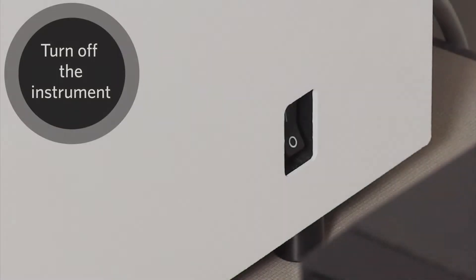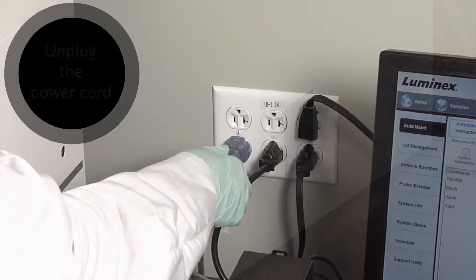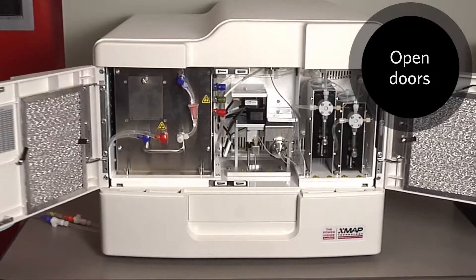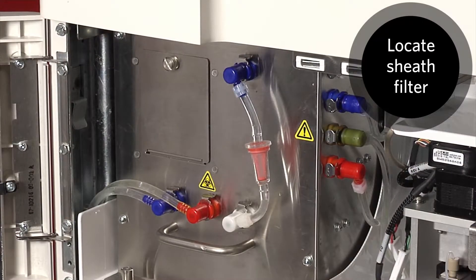Here's how to replace the sheath fluid filter. Turn off the FlexMap 3D instrument and unplug the power cord. Open the left door on the FlexMap 3D instrument and locate the sheath filter on the front of the fluidics bay.